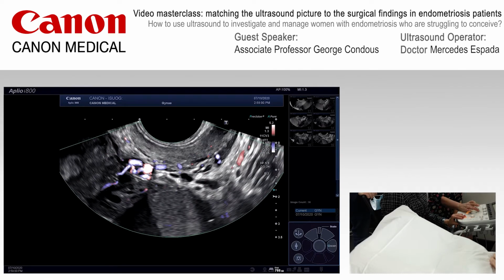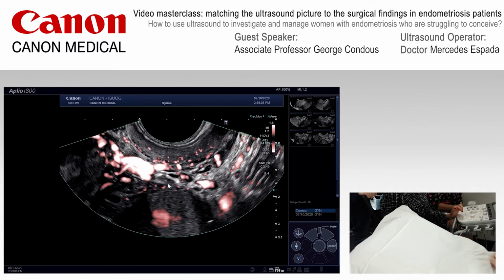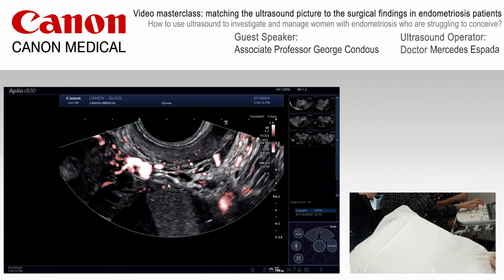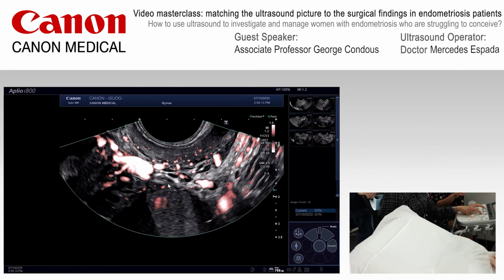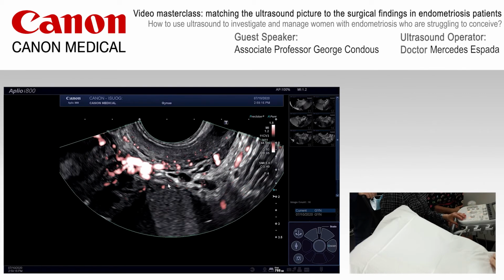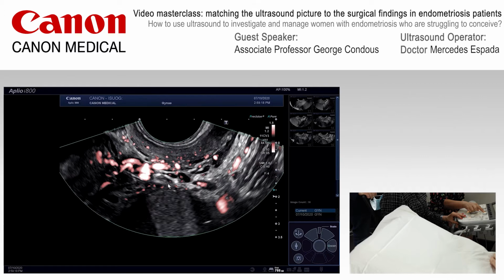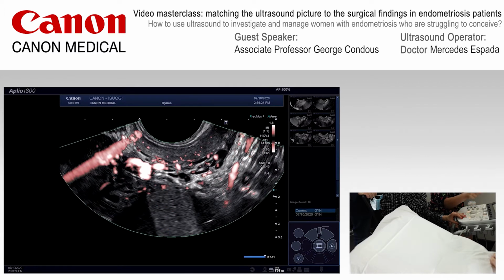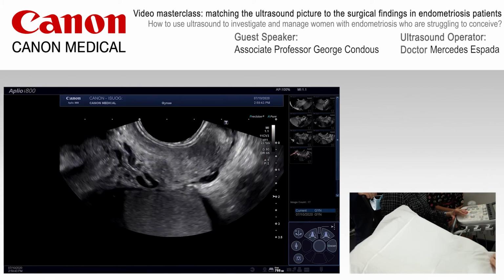So not only do we want to be able to look at and describe the individual lesions from a deep endometriosis perspective and describe these measurements in 3 planes, looking at the ovaries themselves, but more importantly, we want to know if there's distortion of the anatomy and whether indeed there is the presence of adhesions, which in turn means that you're very likely to have more complex surgery that involves exploring the retroperitoneal spaces, the avascular spaces within the pelvis, to restore the anatomy at the start of the procedure before we actually move on to starting to excise the disease.